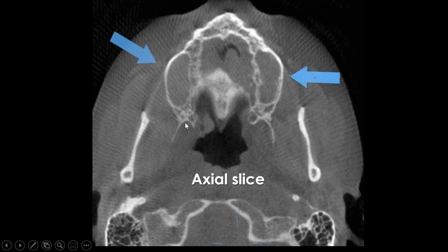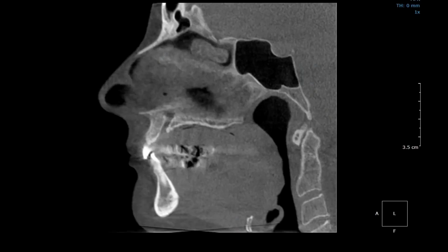I'm showing you the patient's right lateral pterygoid plate, and this is the patient's left lateral pterygoid plate. On occasion, you can actually see the fascial planes surrounding the musculature. In fact, this one is outlined reasonably well. This is the inferior belly of the lateral pterygoid inserting into the condylar head from the lateral pterygoid plate. Hopefully you'll also recognize the mastoid processes, but after that, for many dentists, it's, if you pardon the expression, a crapshoot, okay?